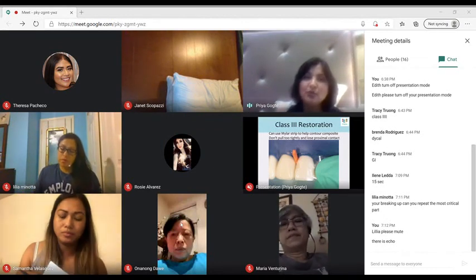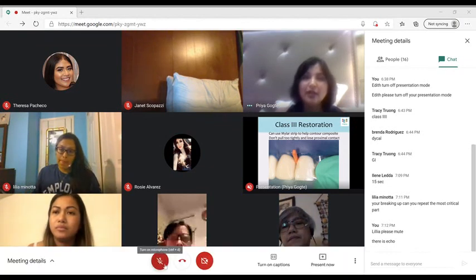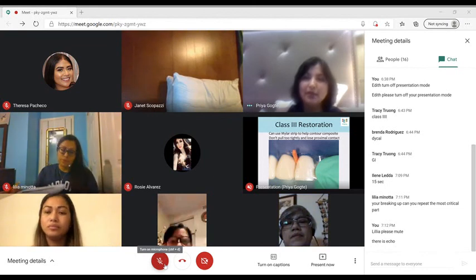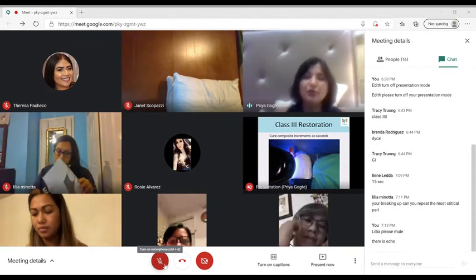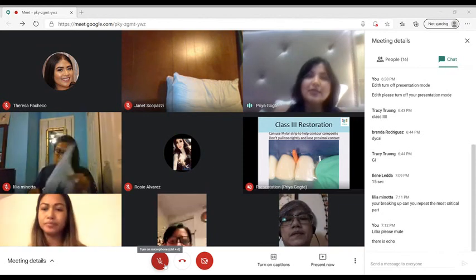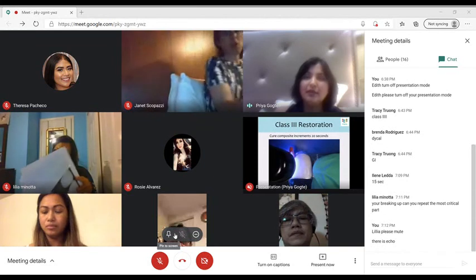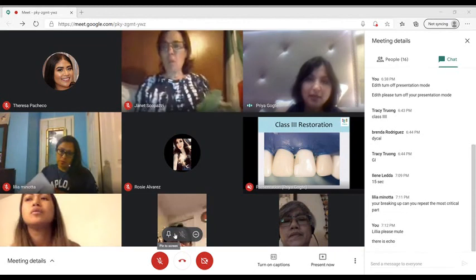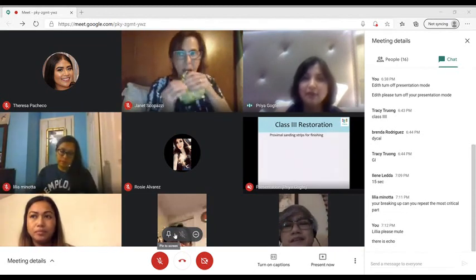So once you have done the composite filling, everything is looking good. You start taking out the wedge and the mylar strip slowly, carefully. And after you've cured all the composite, in this they're saying you just use a mylar strip to kind of help you contour it. And then you cure the composite and you are all done. And then make sure your contacts are good. The flash, you want to remove.